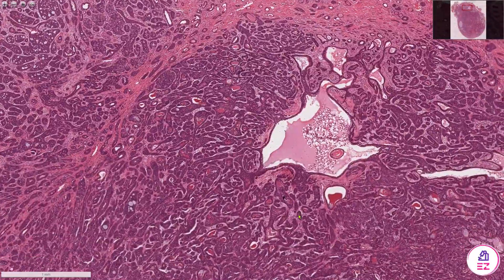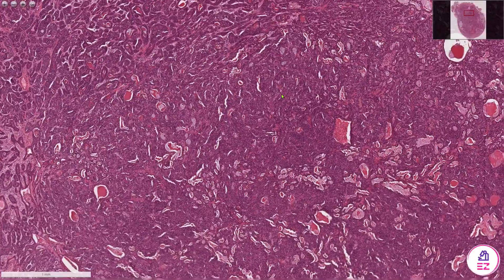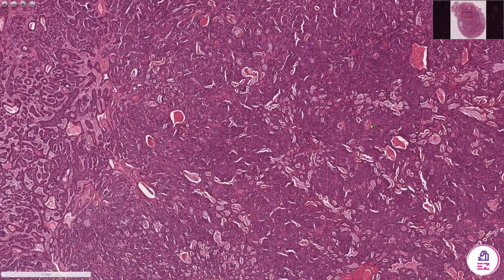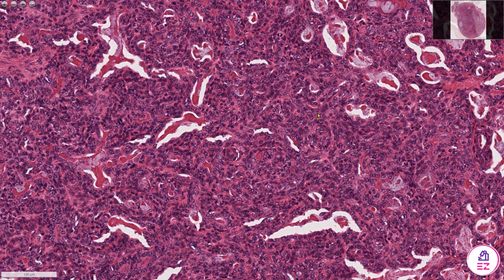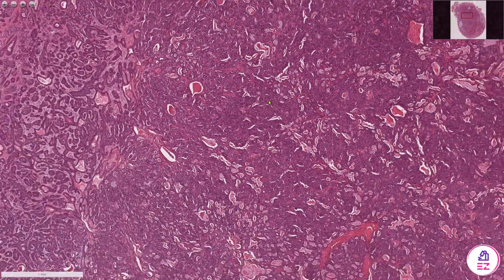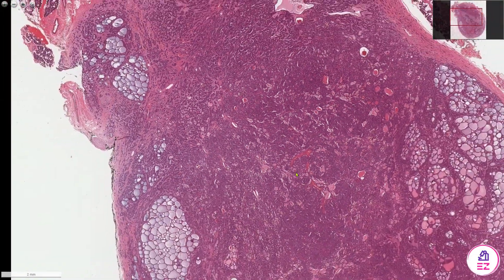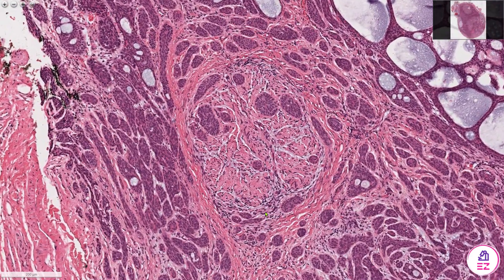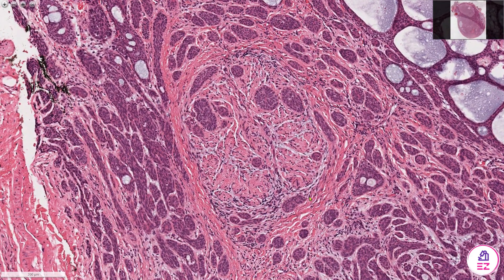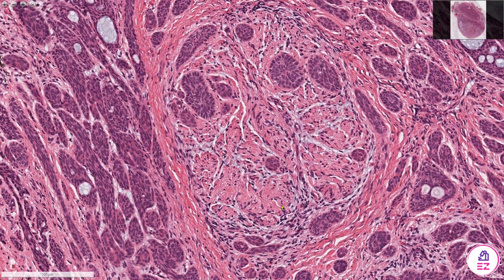The solid component isn't that well demonstrated in this tumour. Perhaps it's beginning to look a bit more solid here, although there are some intervening ductal areas and cystic spaces. One thing adenoid cystic carcinoma is very well known for is growing around nerves. This is a nerve fibre — quite a large one — and we can see nests of tumour within the nerve and also around it.